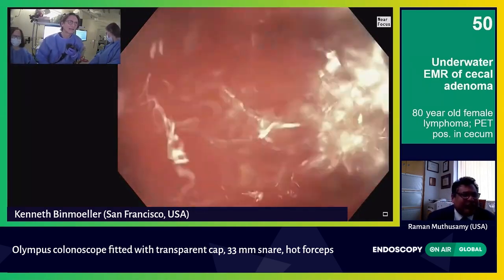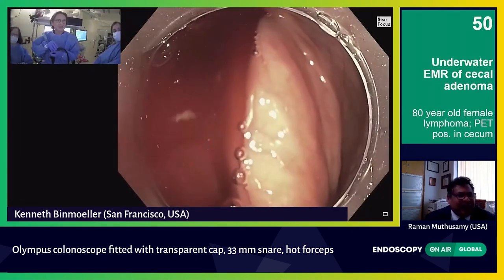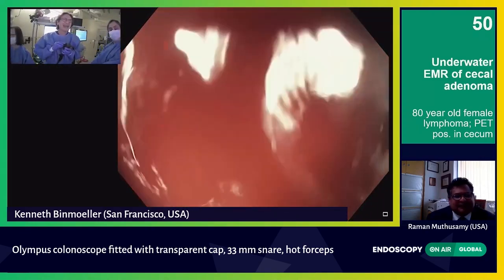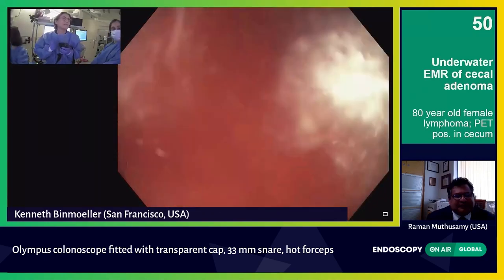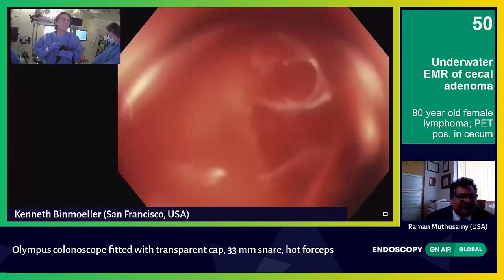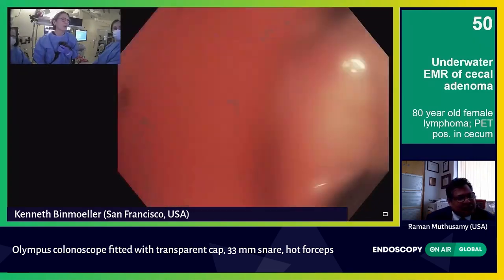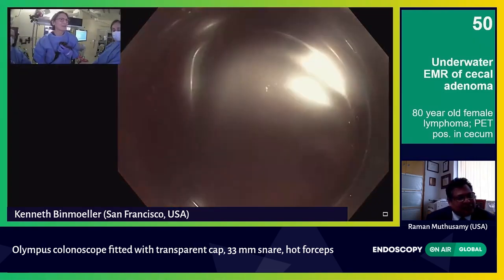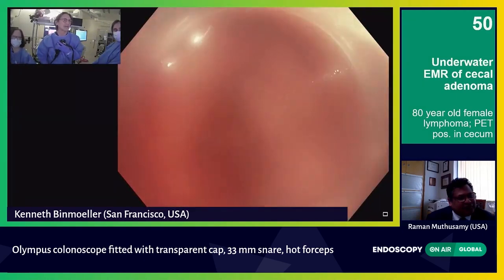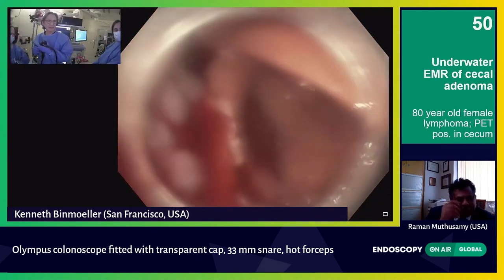Most of the time we use 15 or 20 millimeter snares, but you actually used a much larger one — I use the 33 almost all the time. Now when you put the gas, you have to take off the near focus, because otherwise it's out of focus. The near focus is made for underwater. I do my entire colonoscopy underwater — water exchange, with my foot on the pedal infusing water. There's our huge polyp here. It wants to go back home to its origin. I'm going to try to push it away so I can see the surface. I'm going to start giving more gas so I can see that surface.